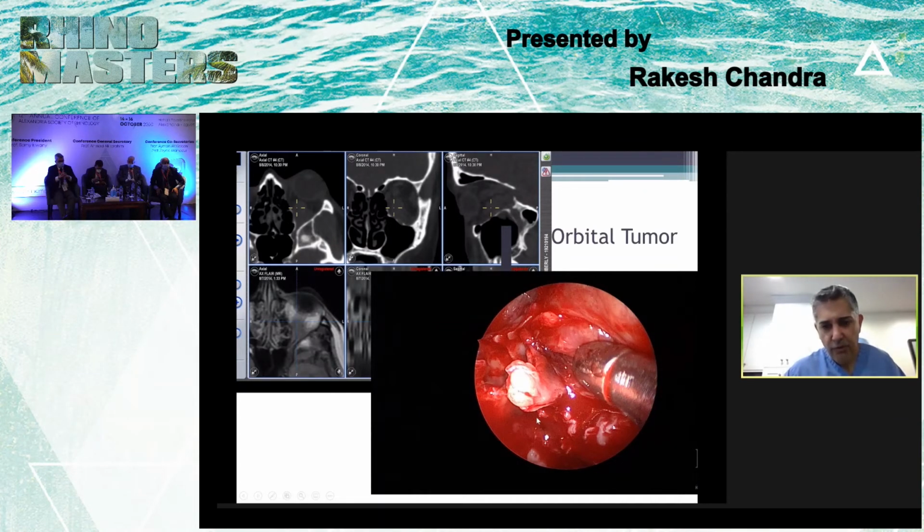We have taken off the medial orbital wall, we've incised the periorbita, we have a little fat there, but with the aid of stereotactic navigation, we're able to get to that tumor quite easily and directly. And this is the most direct approach, with other options being transcaruncular or lots of other external methods that an oculoplastic surgeon would employ.